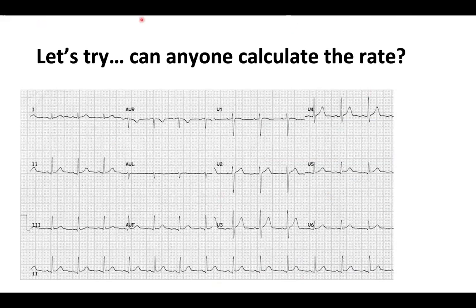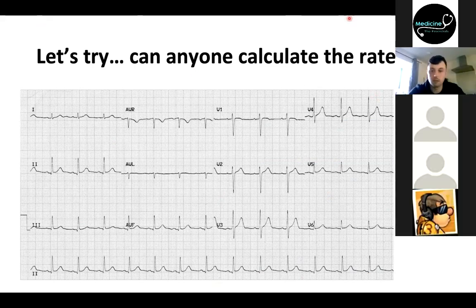Logan, maybe if you could read out the answers, because I can't actually access the chat. Sure. So we've got 136, we've got 100, okay, 75, and from E, they're saying 300 divided by 4.